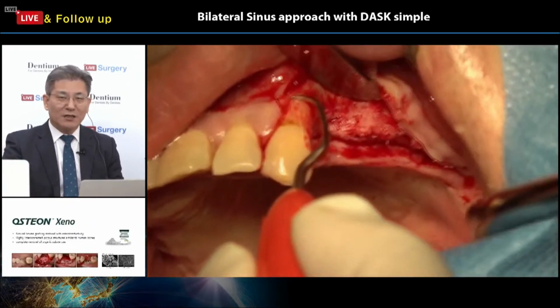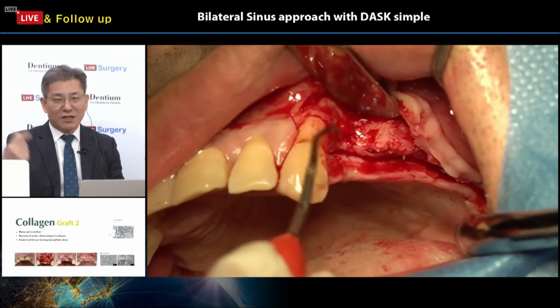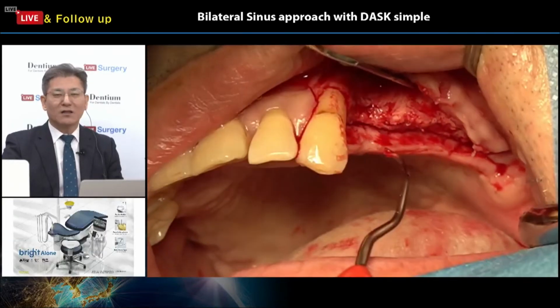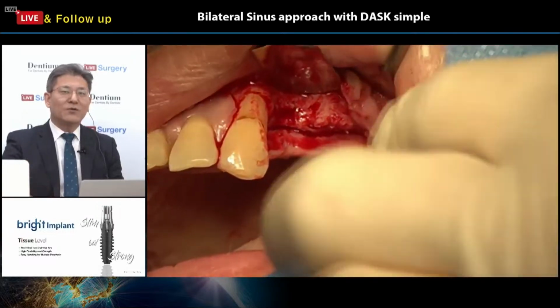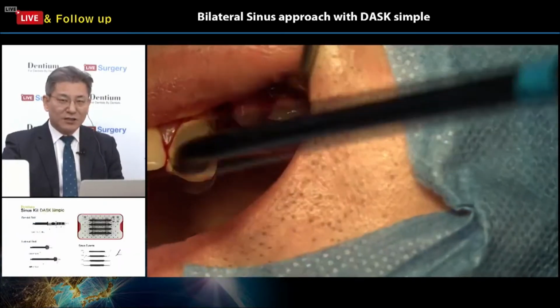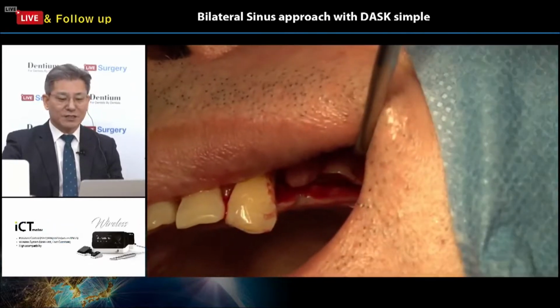GBR, block bone graft, and sticky bone. There are many different ways. However, today Dr. Chung is showing us a minimized, simplified, easy approach to a narrowed ridge like this. How? Using the bright tissue level implant fixture and a simplified GBR procedure.